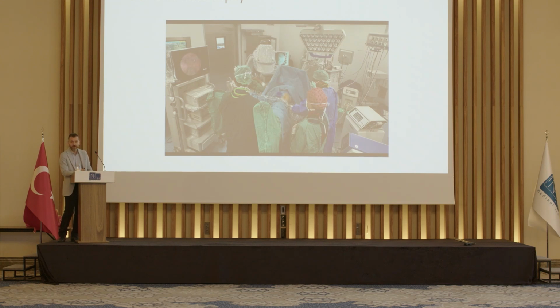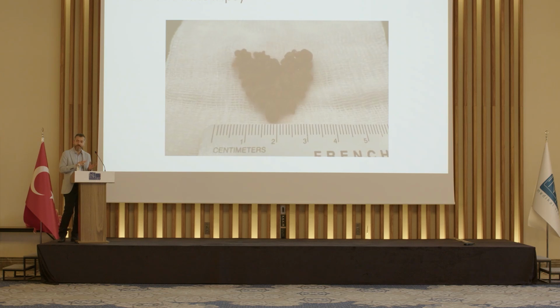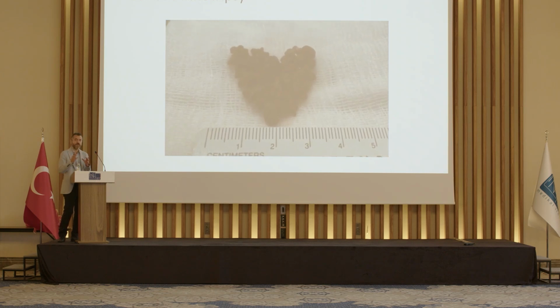About 4 years ago, we published a study about the comparison and combination of the low power holmiums with the ballistic lithotripters, and you can just use them in combination during mini PCNL. It's very efficient. And recently, we also compared for the mini PCNL the high power holmium lasers with the ballistic lithotripsy, and in the end, they are both efficient. But if you do not have a high power holmium, then having a ballistic lithotripter in the OR really helps a lot to speed up the procedure.